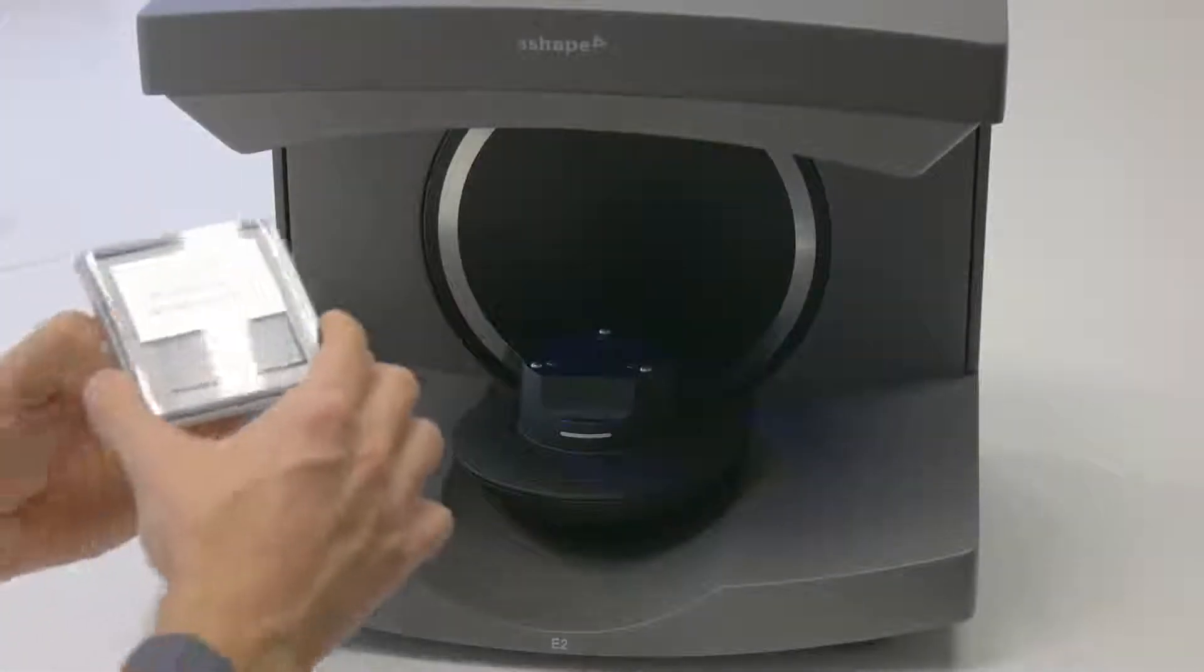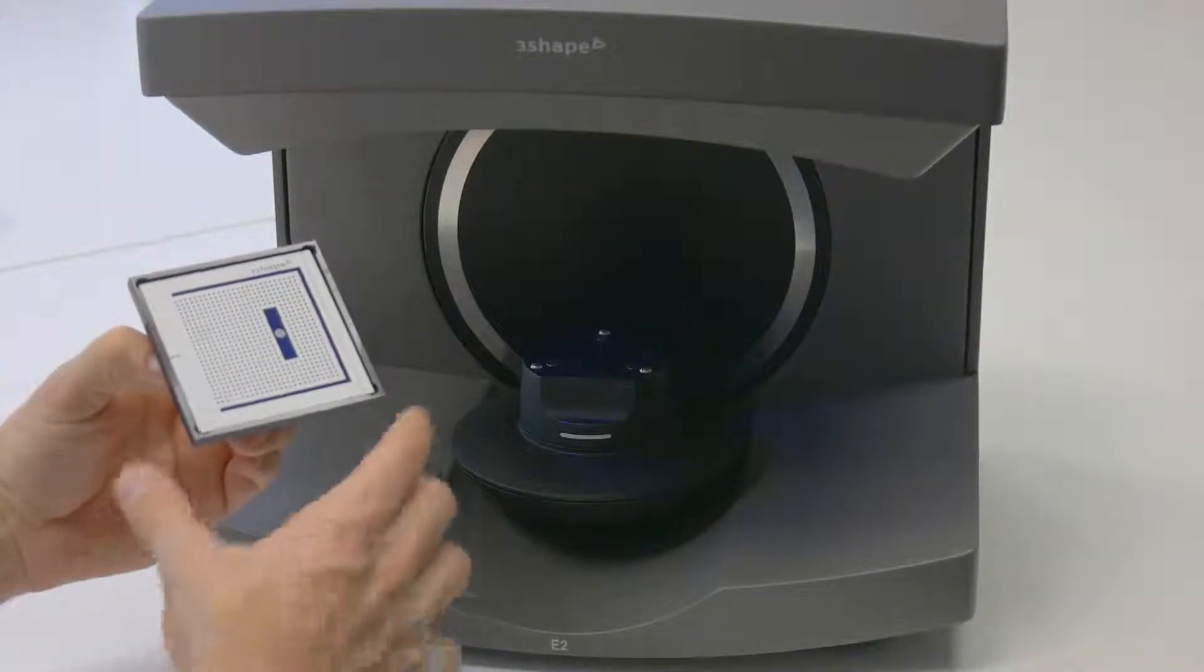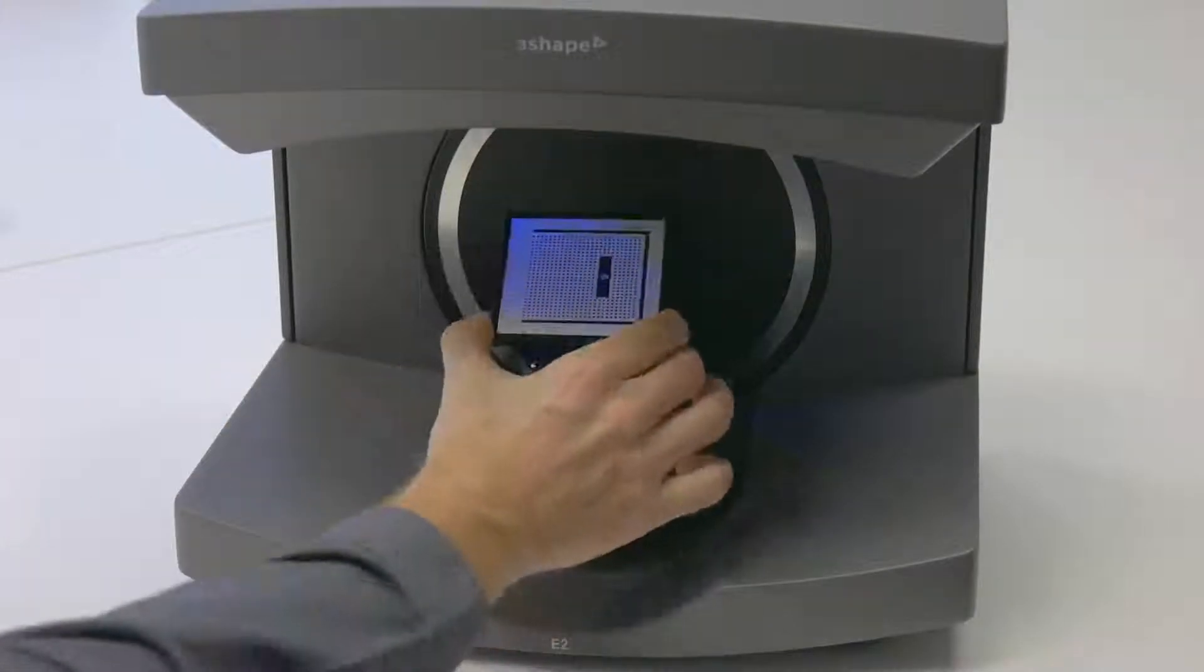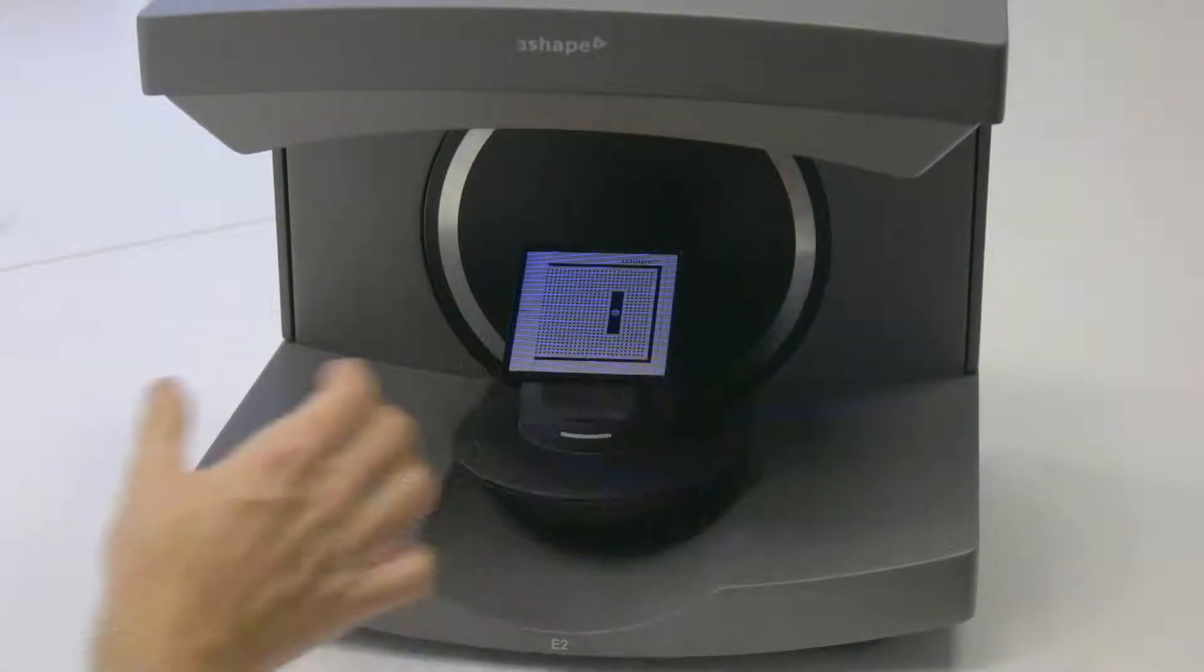Insert the object into the scanner in the way shown on the screen. You will feel the magnetic pull when you place it correctly.